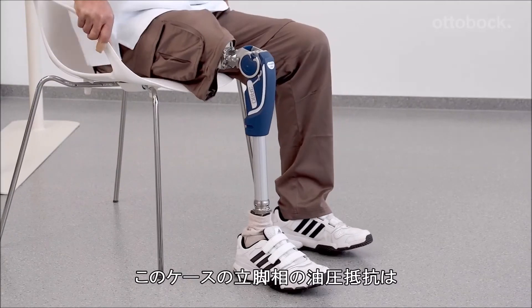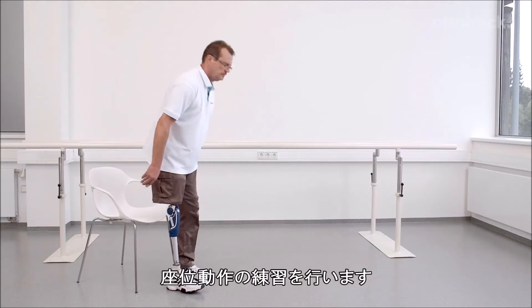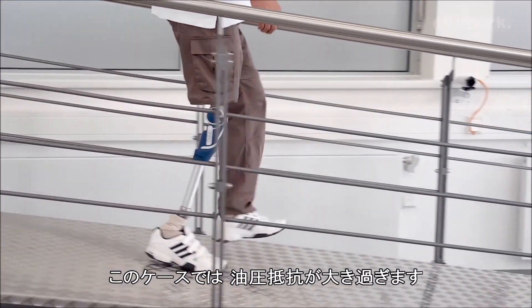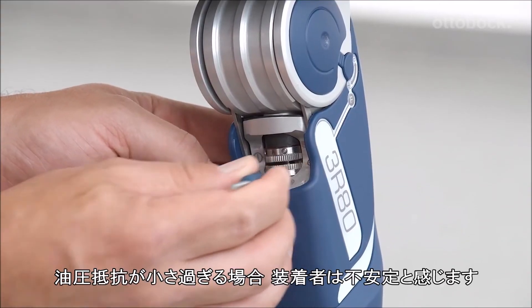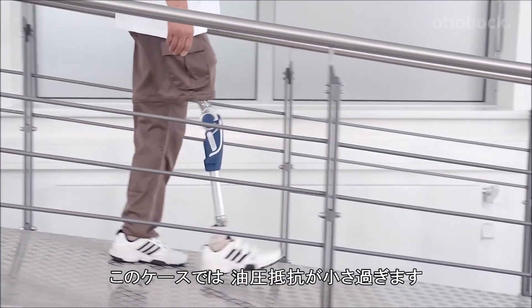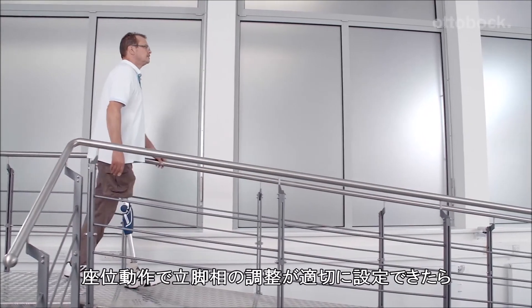With this setting of the stance phase damping, the user has no support when sitting down. The stance phase damping should be increased gradually. Sitting down needs to be practiced; the user needs to learn to sit down with the help of the stance phase damping to relieve the contralateral leg. Here the stance phase damping is set too high. When walking down a ramp, the stance phase damping needs to be gradually decreased. If the resistance is too low, the user could become unstable. At this point the damping is set too low — the prosthesis bends too quickly and prevents the user from taking balance steps. The damping must be increased in small increments.